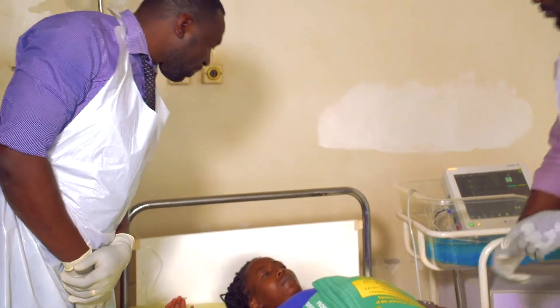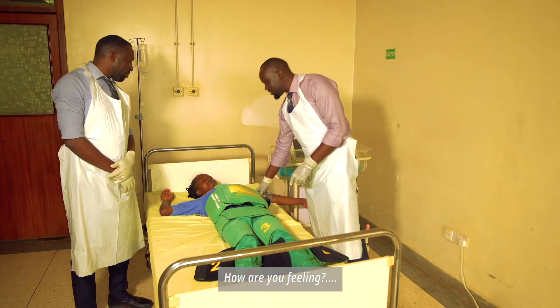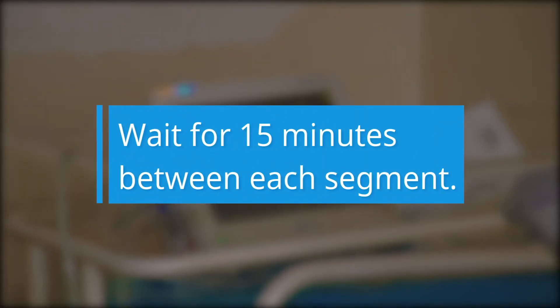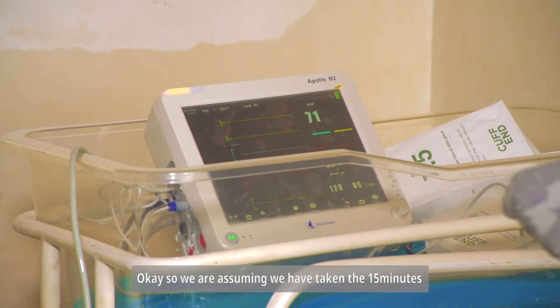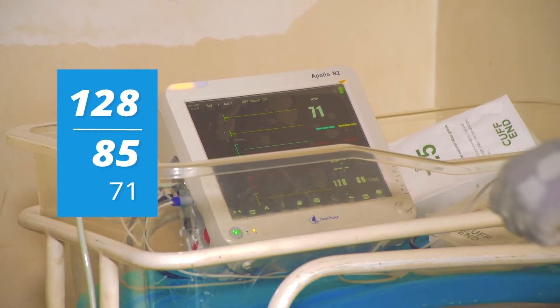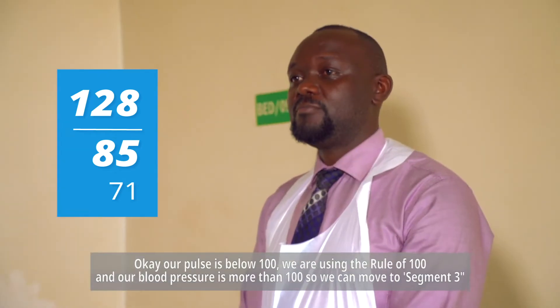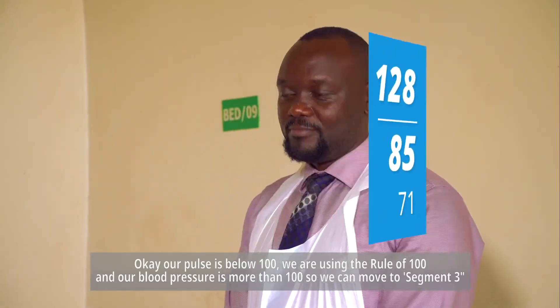We check on our patient — she's okay, and we are not bleeding. The caution here is to wait 15 minutes between each segment for redistribution to happen before you take the vitals. After 15 minutes, our blood pressure is 120 and our pulse is below 100. We are using the Rule of 100, and our blood pressure is more than 100, so we can move to segment three.